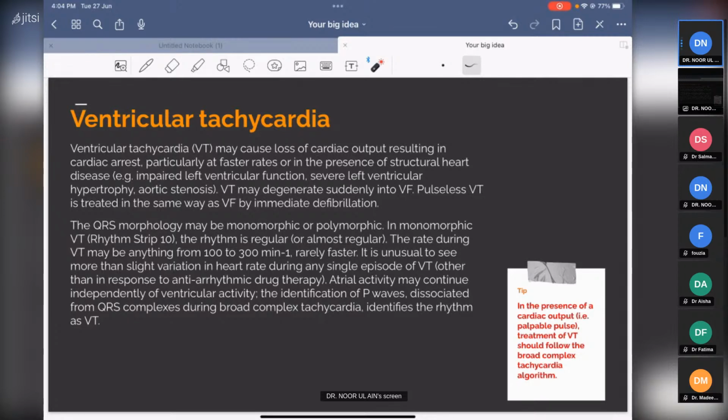But do you think that the atrial activity जो है, yes, exactly, Dr. Fauci, it would be must. It would be like a dissociative pattern. कोई pattern नहीं है. मतलब you would see a P wave and a QRS, too many QRSs, not see a P wave, it's okay. But there is atrial activity, but not really. हमारा जो last question था कि is it linked to ventricular activity? No. ठीक है? Because the ventricles are beating too fast.